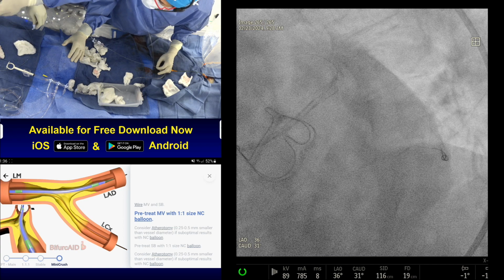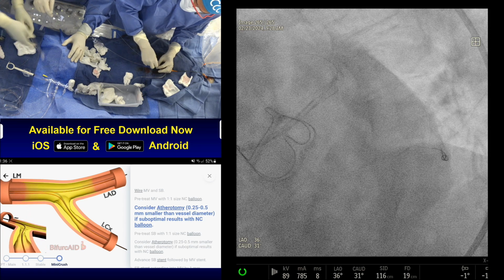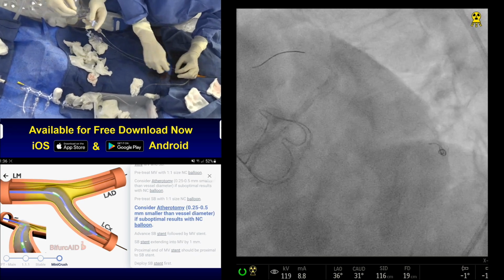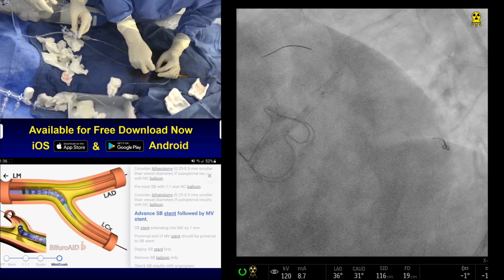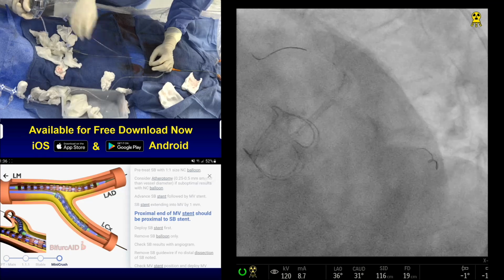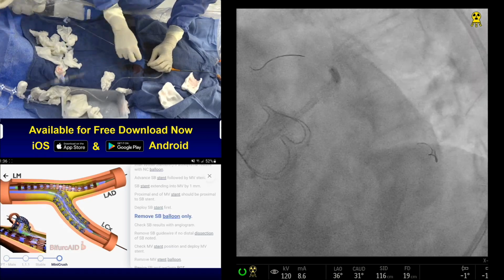Don't do the negative with the syringe. Did negative with the syringe, okay. Yeah. Leave it. Maybe trouble. Good. Okay, but we are now outside, so low pressure, okay? We are not in the stented segment. But you can pull back a little more. May not allow me to get the, okay. Yeah, good.